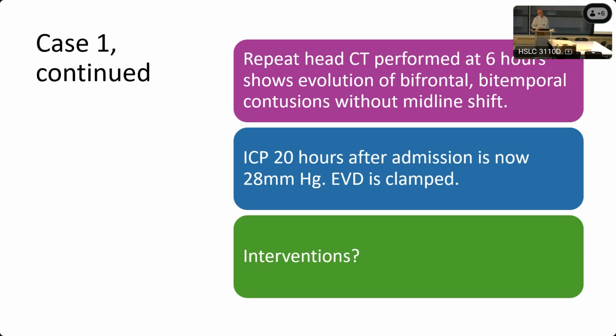And how's that, without even having any electronics attached to it? Tell me how it works. You want to make sure that the pressure transducer is level with the tragus. It's usually a level, and then a string that you can use to confirm that it's at the right level to measure it.